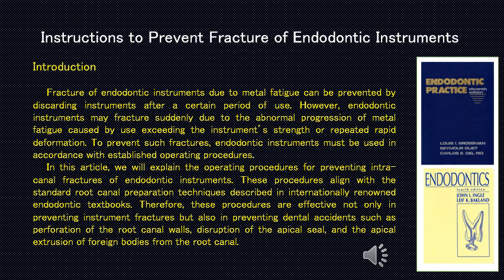These procedures align with the standard root canal preparation techniques described in internationally renowned endodontic textbooks. Therefore, these procedures are effective not only in preventing instrument fractures but also in preventing dental accidents such as perforation of the root canal walls, disruption of the apical seal, and the apical extrusion of foreign bodies from the root canal.